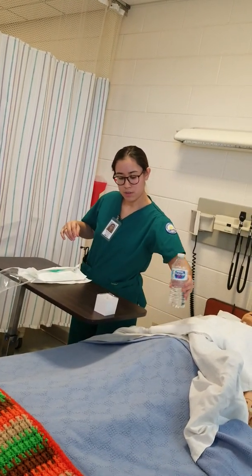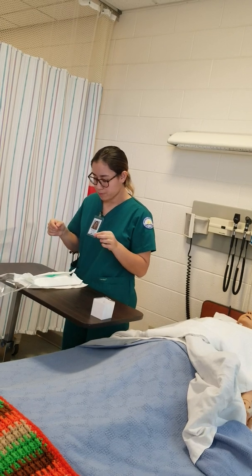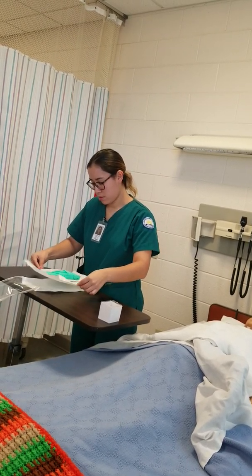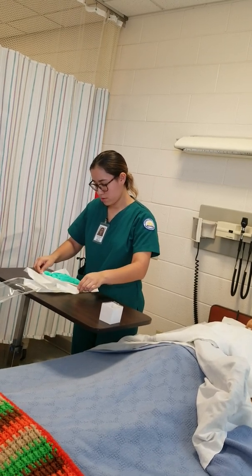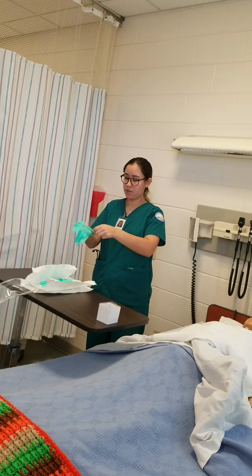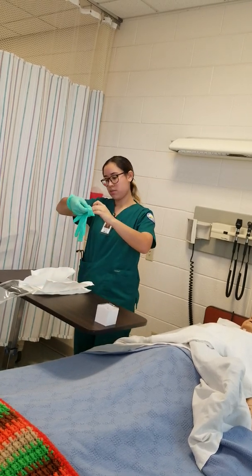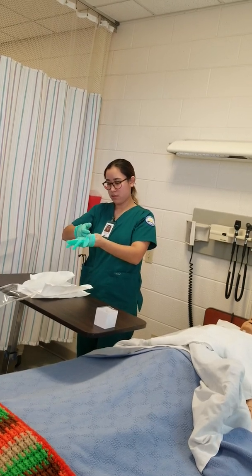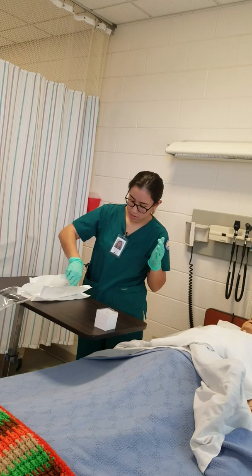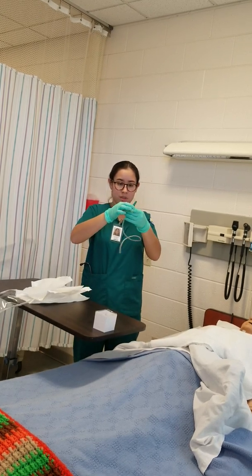Now I'm ready to get into my sterile field. Before I start, I want to make sure I have everything I might need as I go in and out. Now I'm going to open my kit. Sterile gloves are on. I'm going to go ahead and grab the outer one inch and open it.